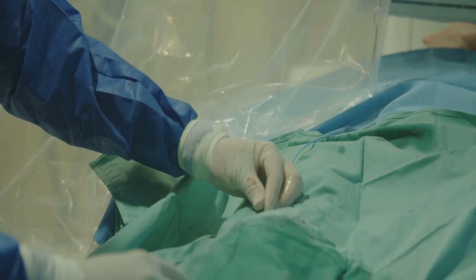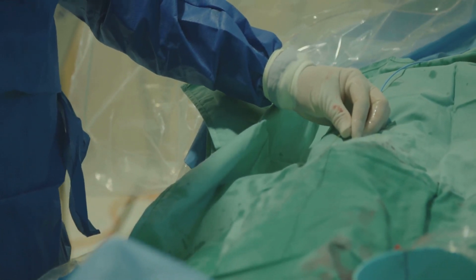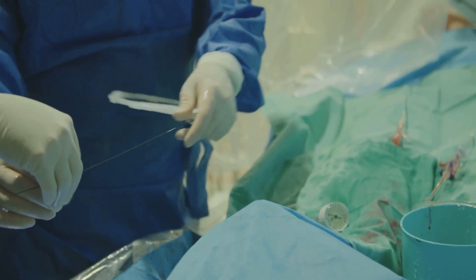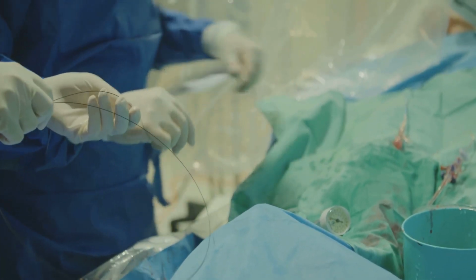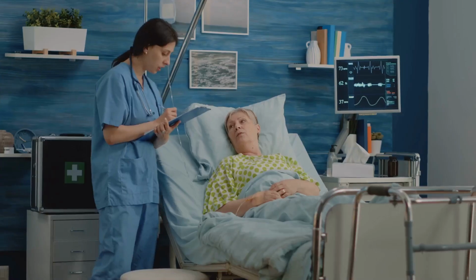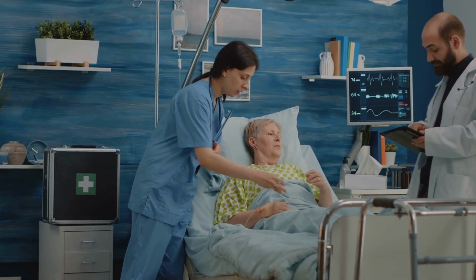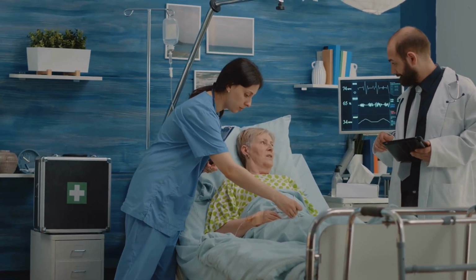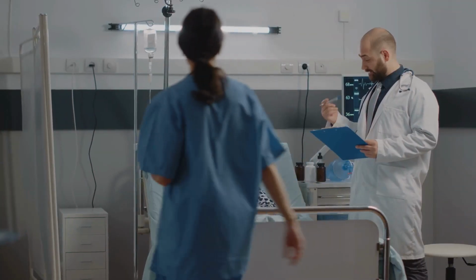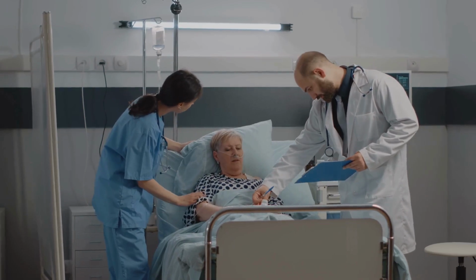The third problem we discussed was catheter dislodgement, a problem that can cause discomfort and potential harm. The solution to this, as we've learned, lies in secure and correct placement of the catheter, along with regular checks to ensure its position and integrity. Throughout our discussion, a common theme has emerged: the importance of preventative measures and proper catheter care. These are not merely solutions to specific problems, but fundamental principles that should guide all interactions with urethral catheters.